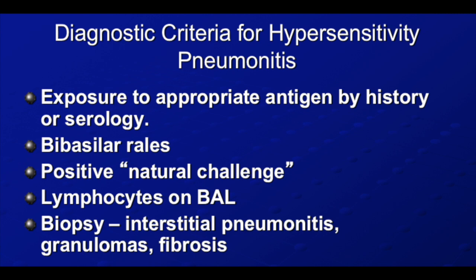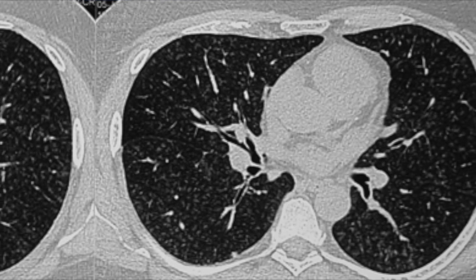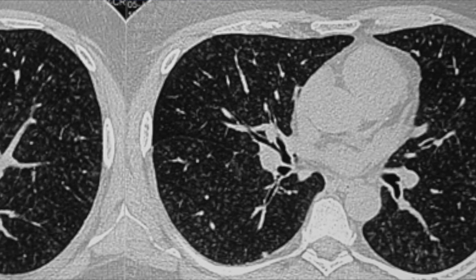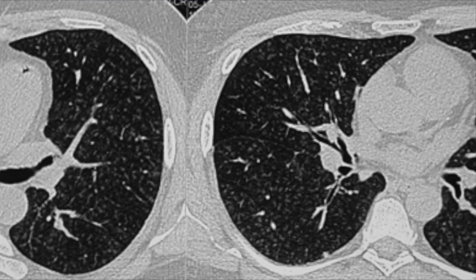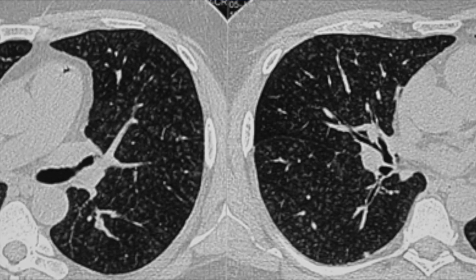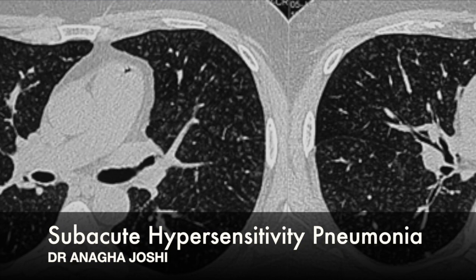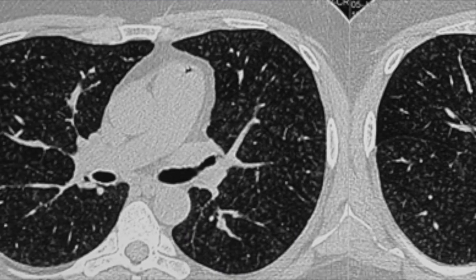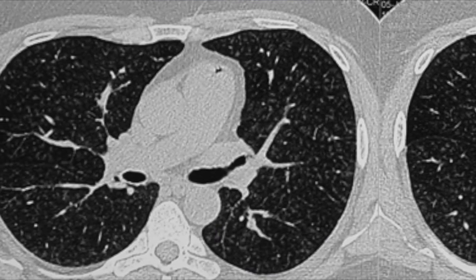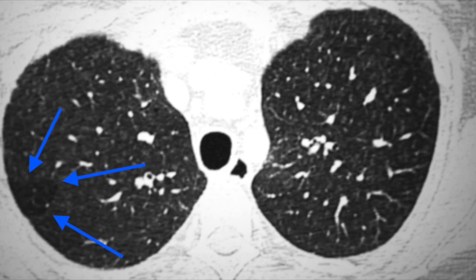If you can appreciate, these are the small ground glass density nodules scattered in bilateral lungs without any traction bronchiectasis or honeycombing. At least there are no lymph nodes. So this is most likely suggestive of subacute HP, but you need of course your pathologist or the microbiologist for serology.